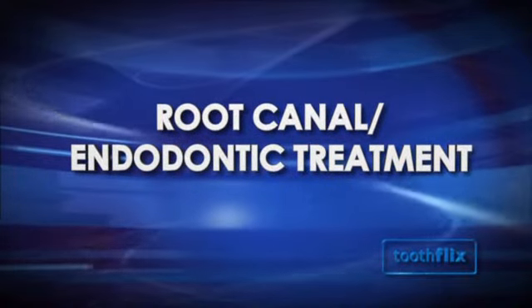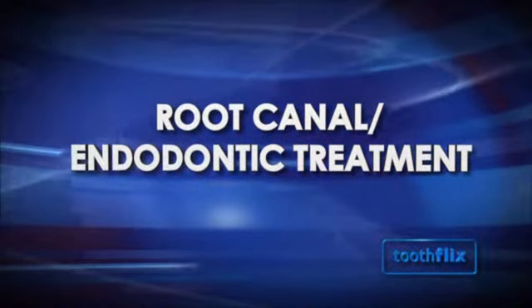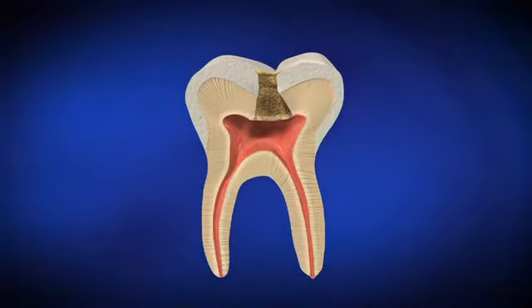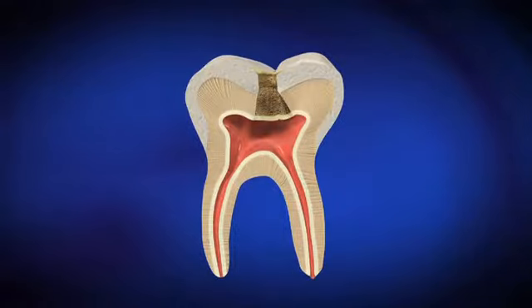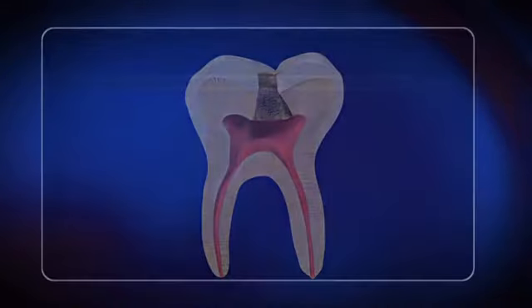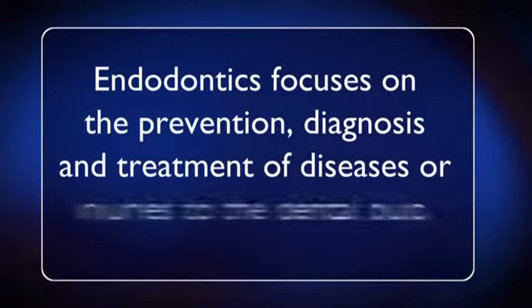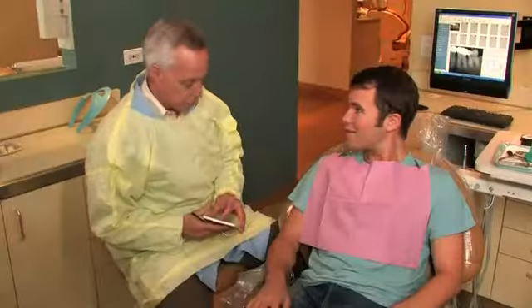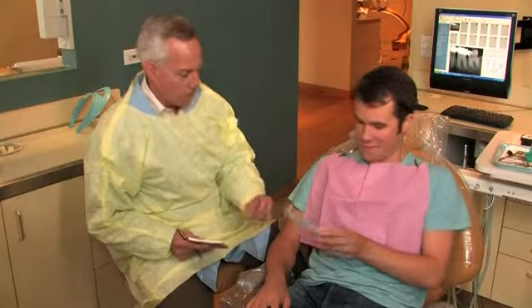One way a tooth can be saved is with root canal, or endodontic treatment. Root canal treatment is a procedure to remove injured or infected dental pulp. The pulp is the soft tissue inside the tooth that contains nerves and blood vessels. Endodontics is the branch of dentistry that focuses on the prevention, diagnosis, and treatment of diseases or injuries to the dental pulp. And dentists specializing in root canal treatments are called endodontists.